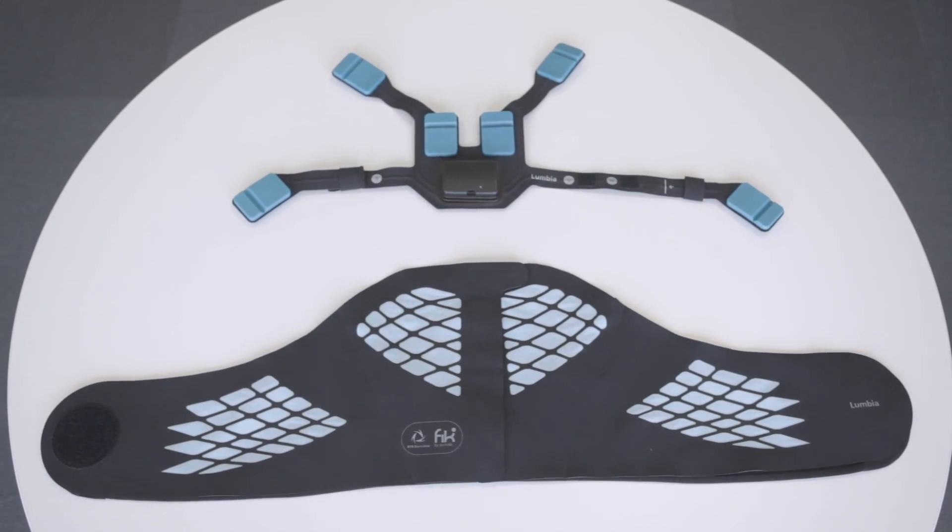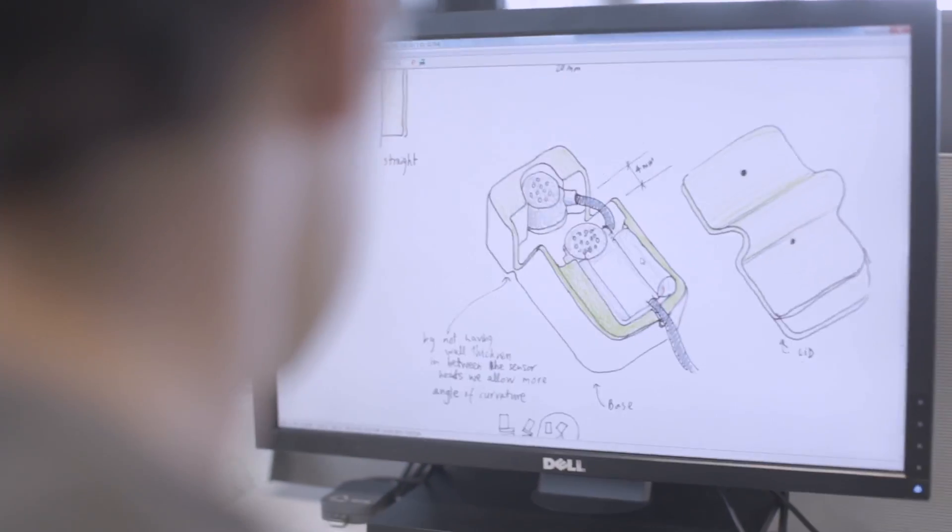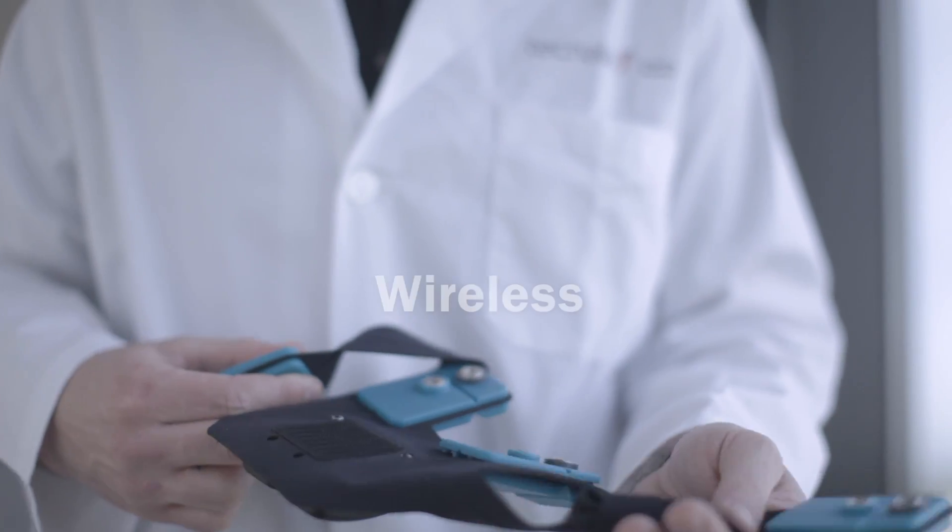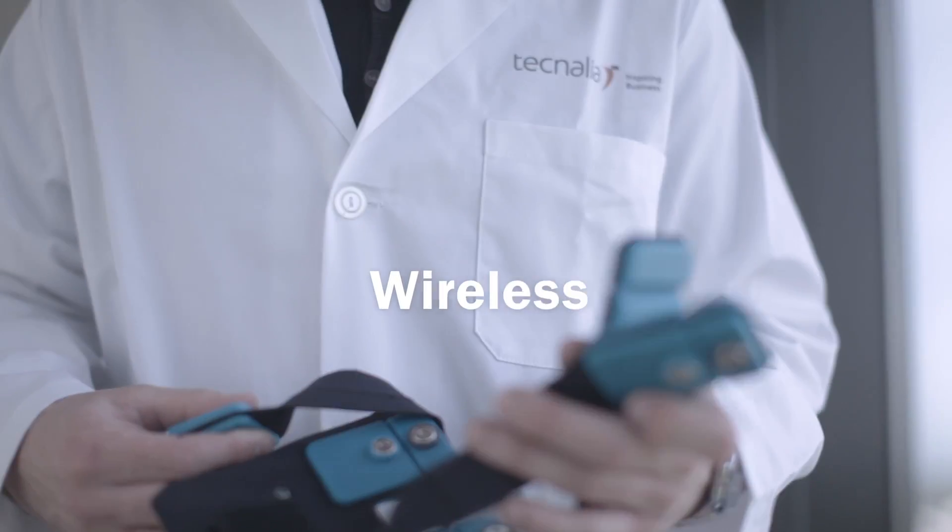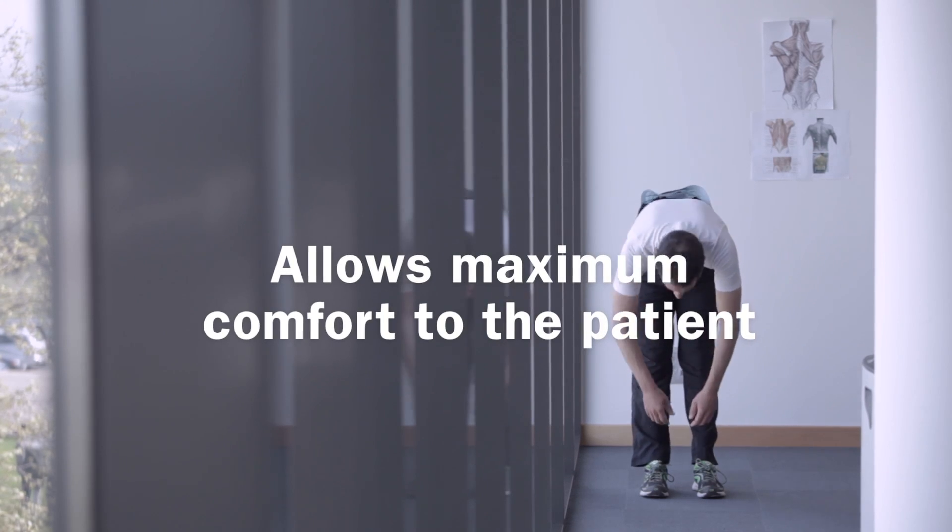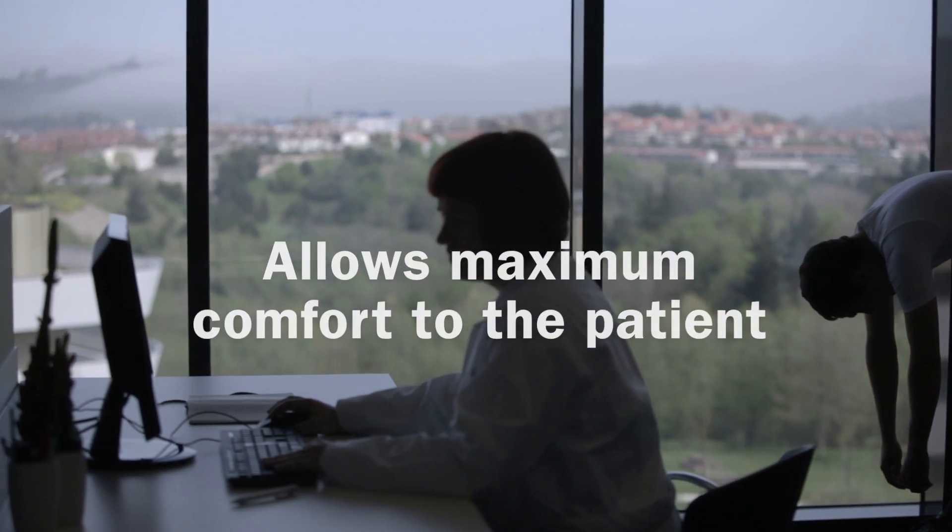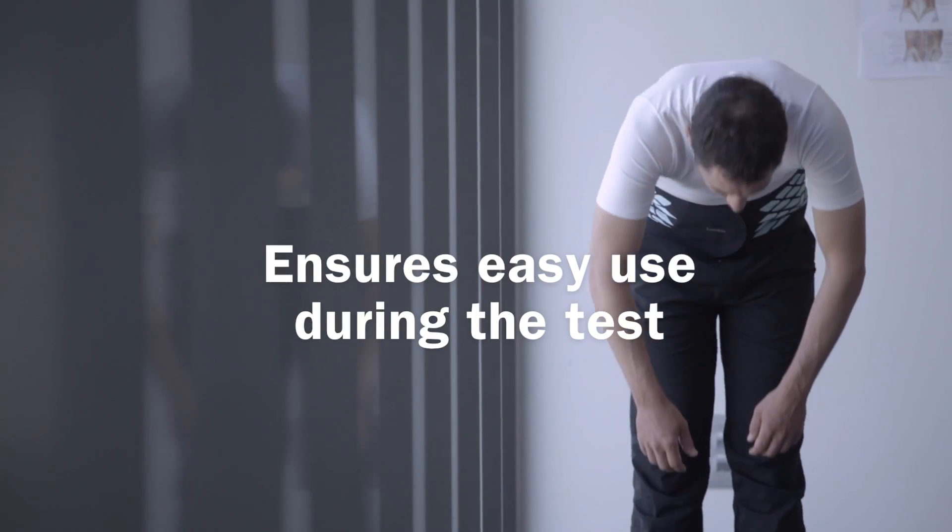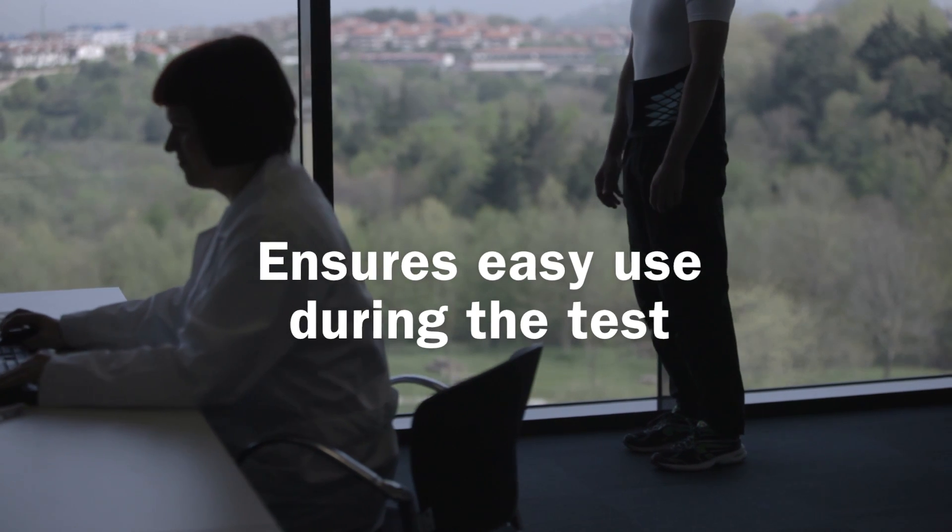Both data acquisition and feedback control are done wirelessly, allowing maximum comfort to the patient. The absence of wires maximizes patient comfort and allows total freedom of movement during assessment sessions as well as during the treatment itself.